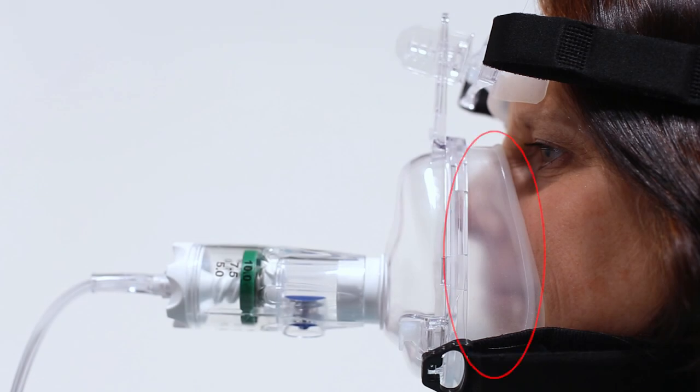It is made from silicone, which will enable you to get an effective seal in the pre-hospital space. And it has an adjustable omni-clip on the forehead to enable you to get a perfect fit.